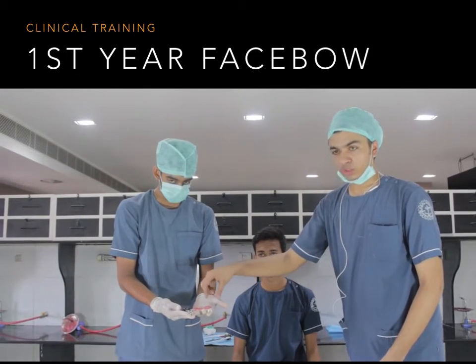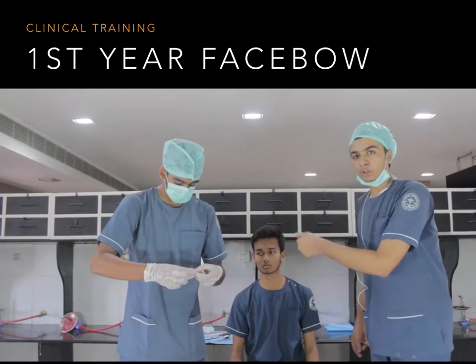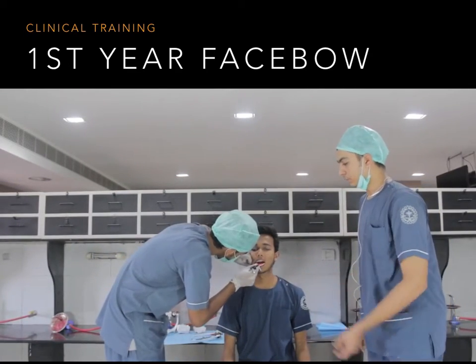We adapt wax over it — we take wax and adapt it over the bite fork, and then we attach it to the 3D jig. Then we put it on the patient and record the bite. This is how we are going to record the bite of the patient.